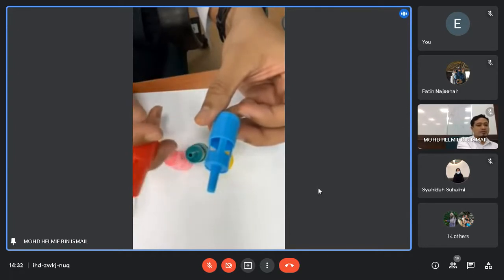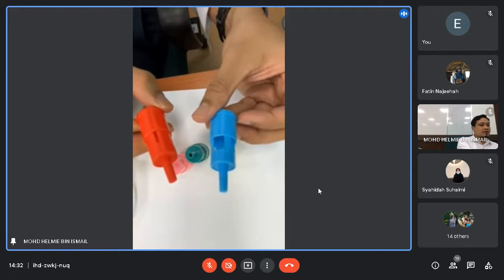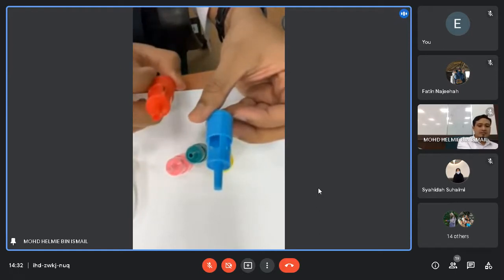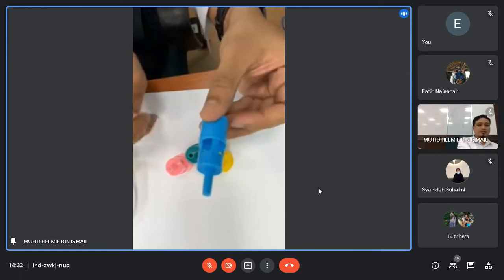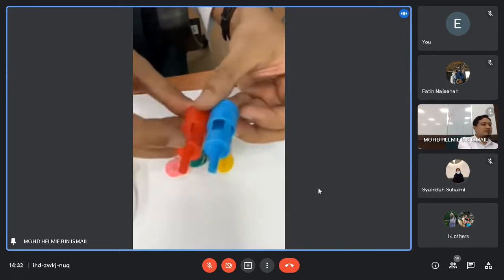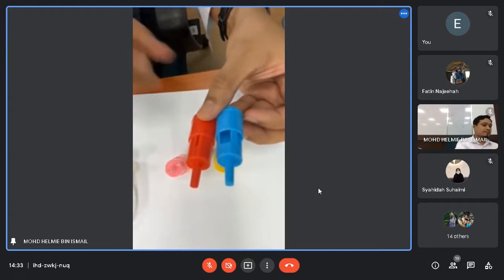That's why oxygen from the room air will enter through our valve. The bigger the valve, the more room air is sucked into the venturi valve, leading to a lot of room air mixture in the venturi mask. So the smaller the valve, the less room air is sucked into the venturi valve.